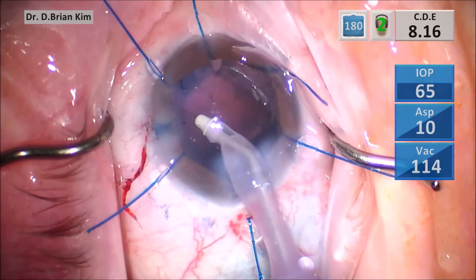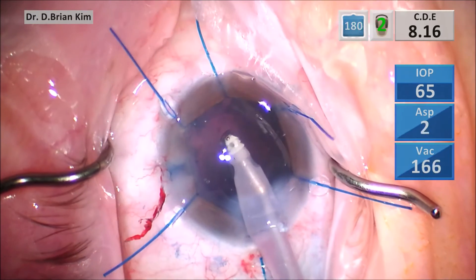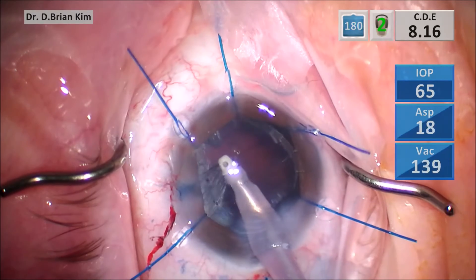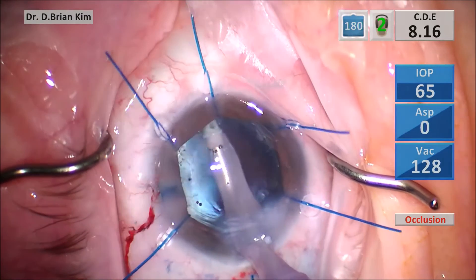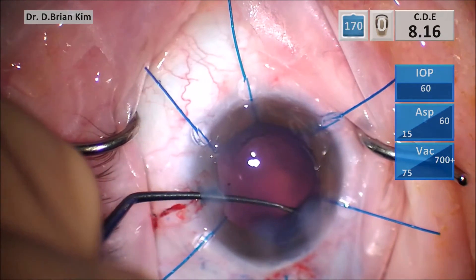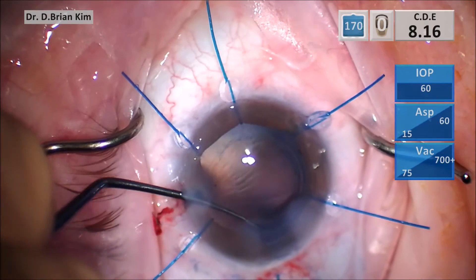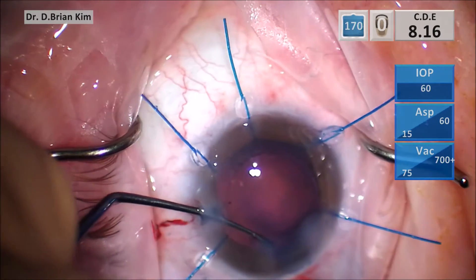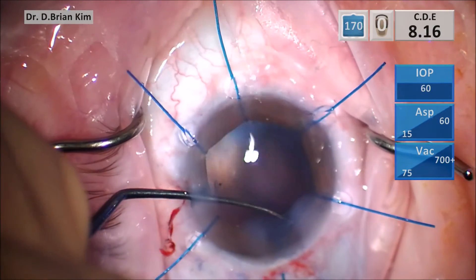When you remove the cortex you want to sweep tangentially side to side, because the zonules are weak. If you pull radially you'll stress the zonules, which you don't want. Tangential forces help tease away and loosen the cortex. For weak zonular cases, you also want to remove lens epithelial cells — you can use the IA handpiece as well as a Singer sweep to polish underneath the anterior capsular surface.